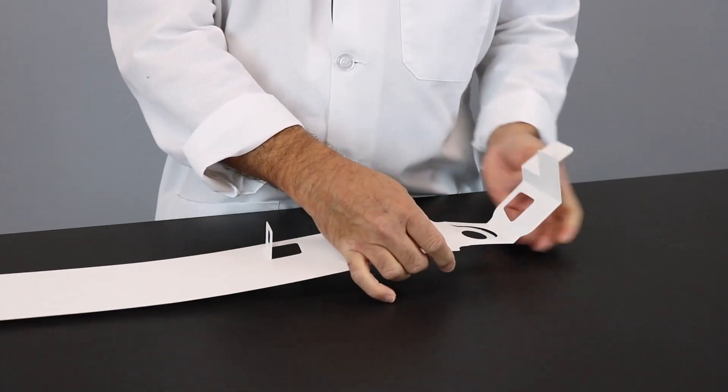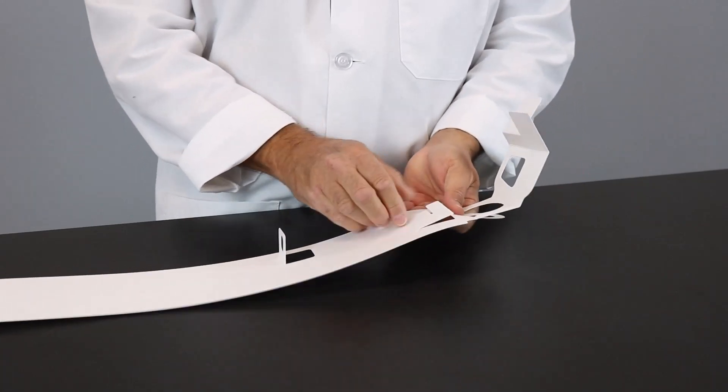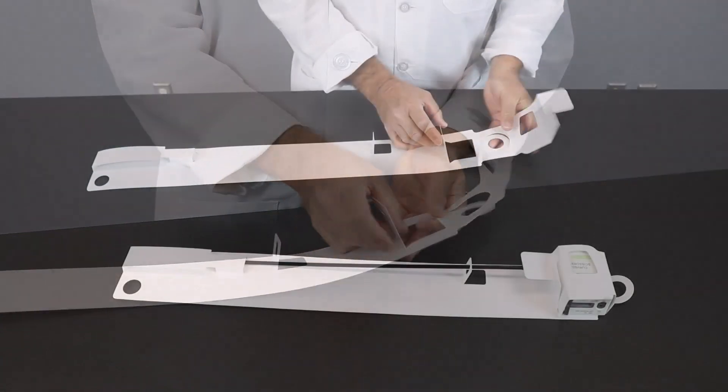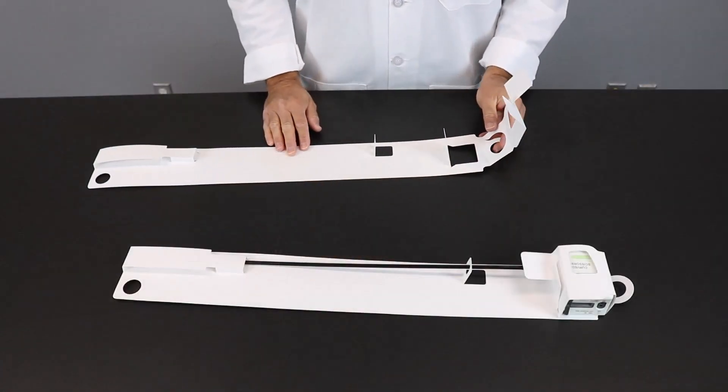Then take the bottom flap here, the last part of the locking tab, fold it down at that score line, make a crease, and now you're ready to insert the instrument.